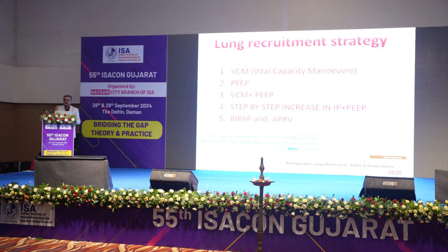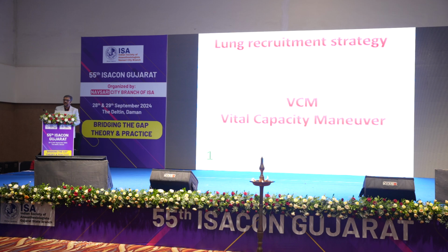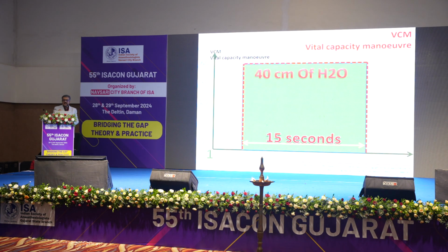The literature discusses various techniques of recruitment: vital capacity maneuver, vital capacity maneuver followed by PEEP, step-by-step increasing of the inspiratory pressure, and PEEP. We'll discuss the first 3 because of time, and I'm not going to focus on all 5. So what is the vital capacity maneuver? Maintain a sustained pressure of 40 centimeters of H2O for 8 to 15 seconds. This will open all the atelectatic area.